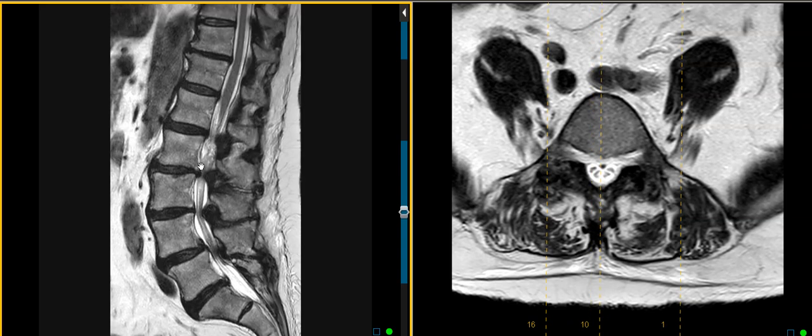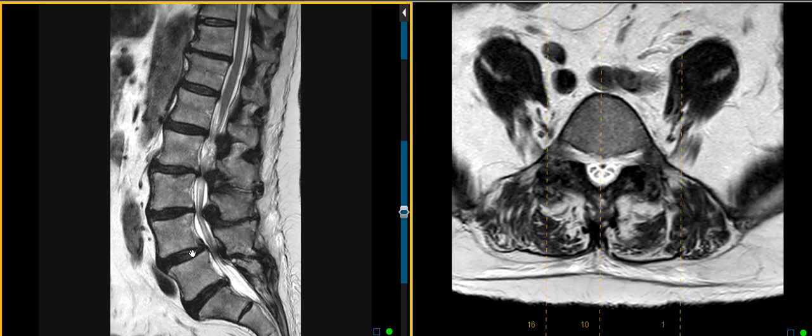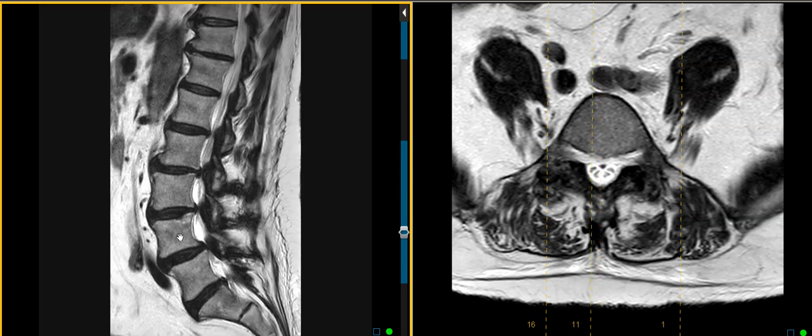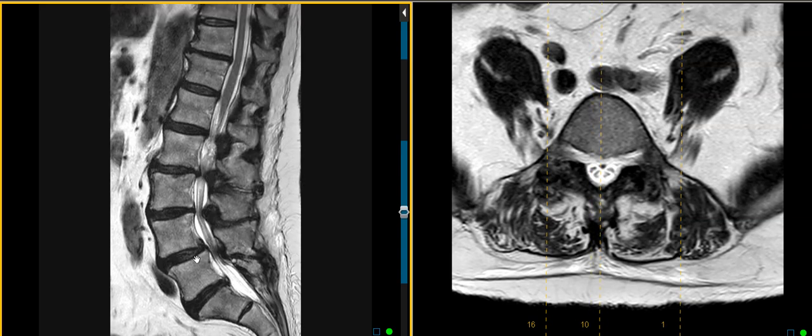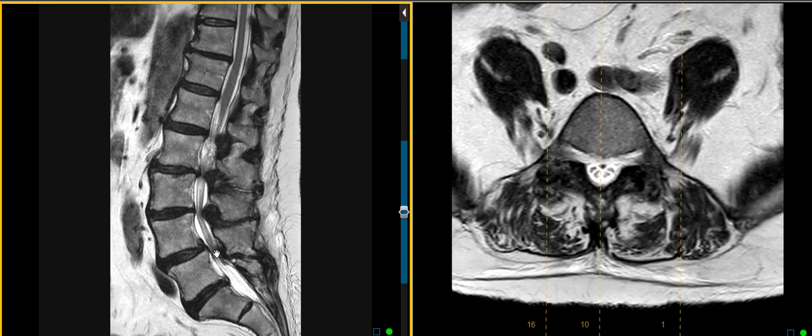But again, at the L2-3 level, we have a severe central stenosis. L3-4, the spinal canal is moderately narrowed related to this thickening of the ligamentum flavum. We call it posterior element hypertrophy when you get this thick ligament and facet arthropathy. Down here at L4, L5, we see L4 is subluxed forwards a little bit, and that subluxation and also this posterior element hypertrophy down here are causing a severe stenosis. So two areas of severe stenosis.